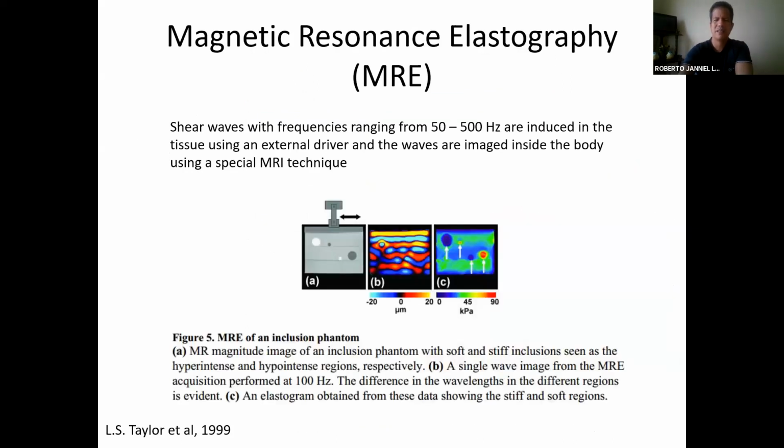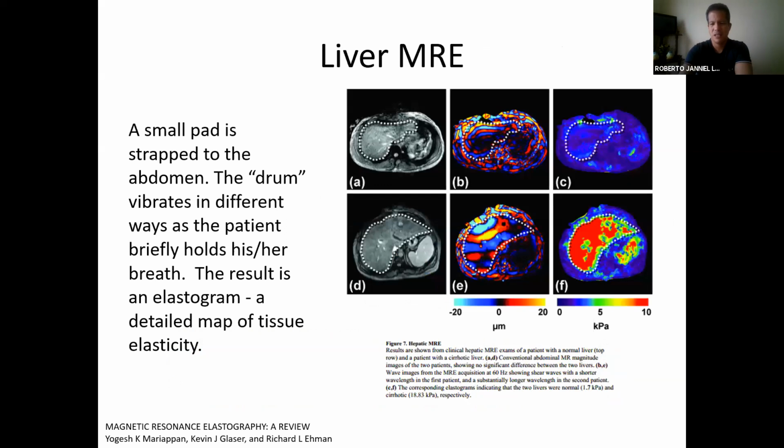Let's keep ahead. So there's magnetic resonance elastography, which is very interesting, right? You're basically applying low frequency vibrations, and these are imaged with an MR device. So just from that, you know that the technique is going to be super slow, right? But it's very interesting, actually, in the sense that, for example, at the Mayo Clinic, this was a technology that would have replaced, or did replace, the use of liver biopsies for staging of fibrosis. So this was a very monumental discovery, MRE, which again is mainly used for the liver, right?